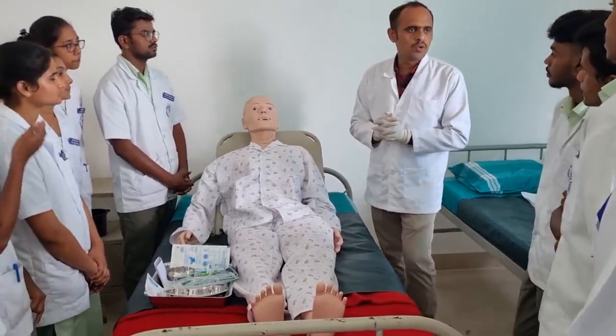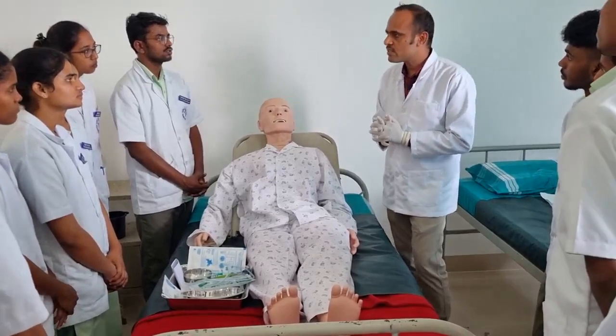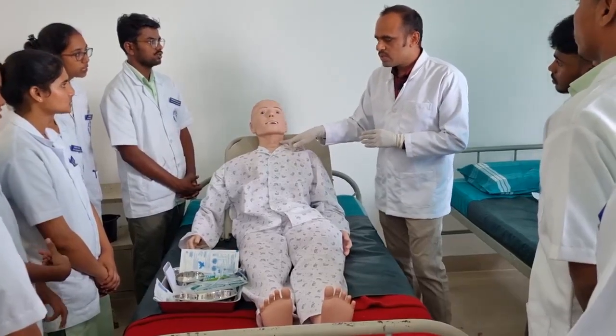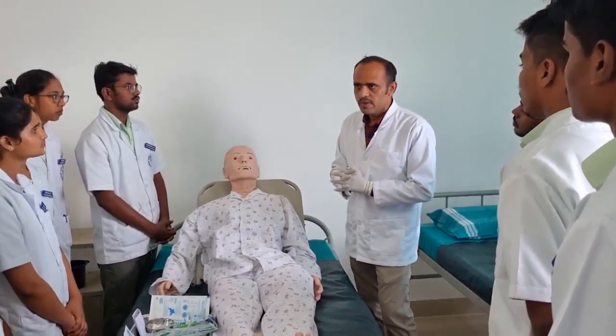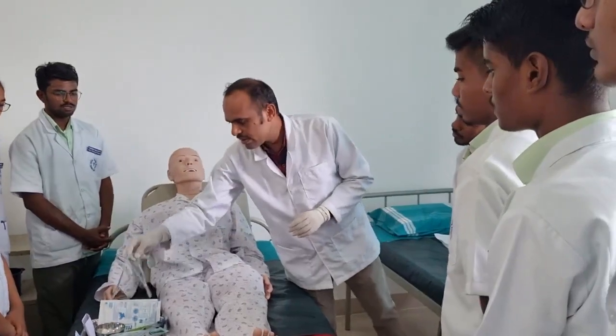So how will you define NG tube feeding? That is the procedure of insertion of a tube from the nostril via the esophagus to the stomach. Okay, so that is the definition of NG tube feeding. Regarding the NG tube, there are various sizes.